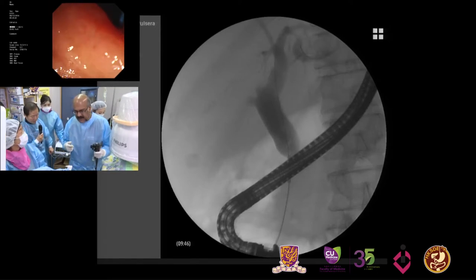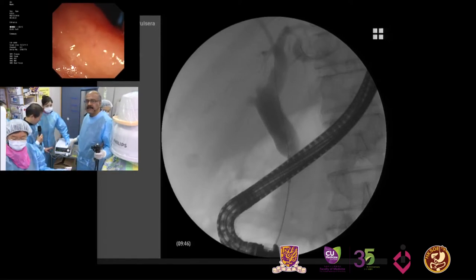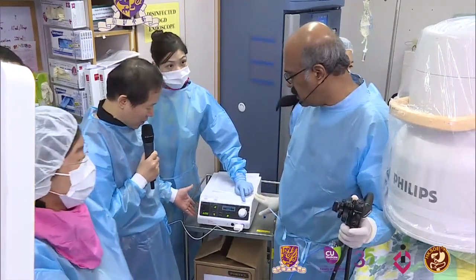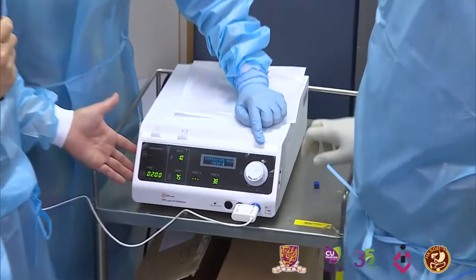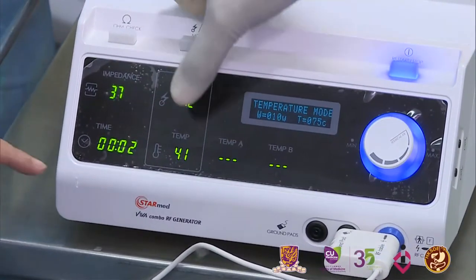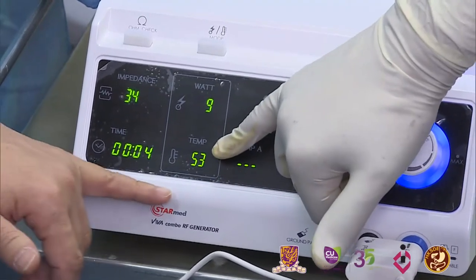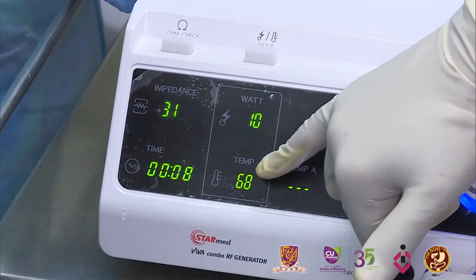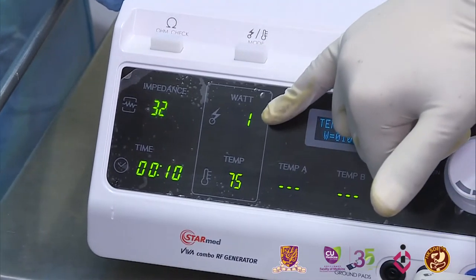Now we'll start to activate the system. For that, I think the cameraman should focus onto the system here. This is the generator. We'll show them what the important parameters are. The most important part is the temperature here. You can see the temperature is set at 75. It should be between 75 to 80. It adjusts automatically. The wattage is 10 watts.